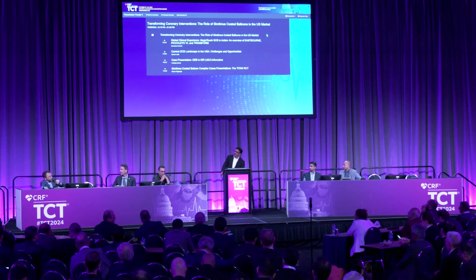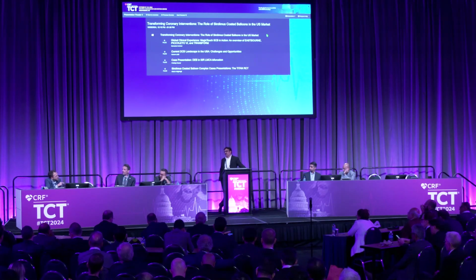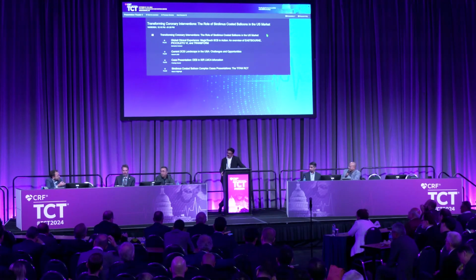Yeah, I would just continue the discussion that you already started. You said that ESC gives class 1 indication to imaging, which is completely true. At the same time, ESC gives a preference to DES implantation in ISR based on studies in which the mechanism for ISR was not addressed by imaging, was just randomizing patients to DES versus drug-coated balloon, which is nonsense. I mean, as we were speaking, first you need to address the issue. Why do you have ISR?